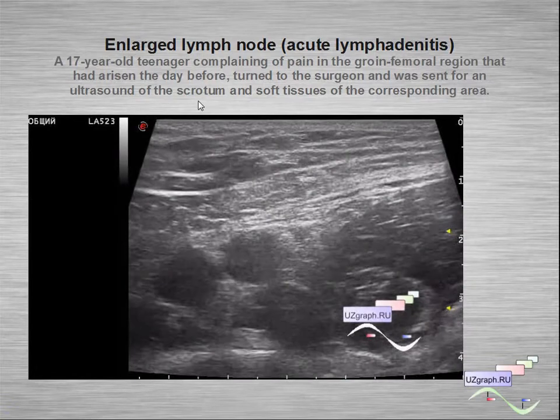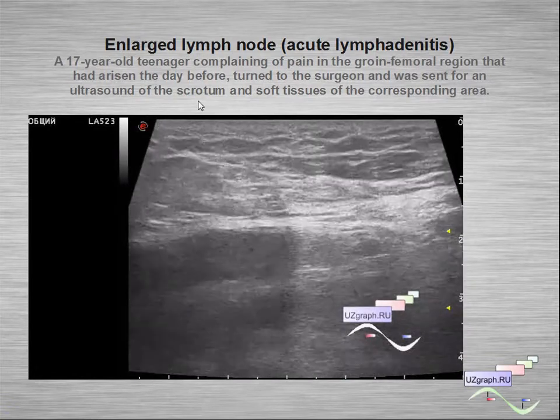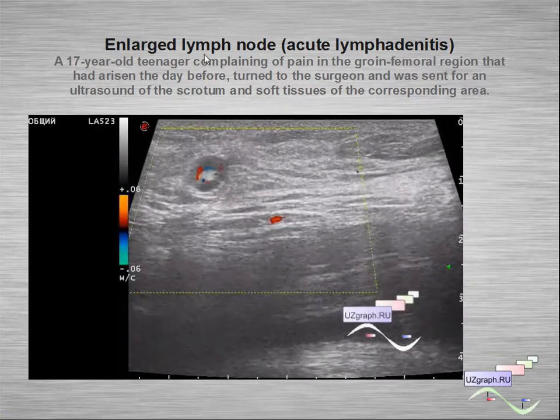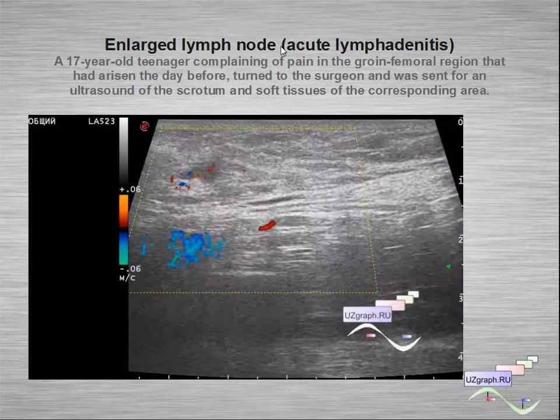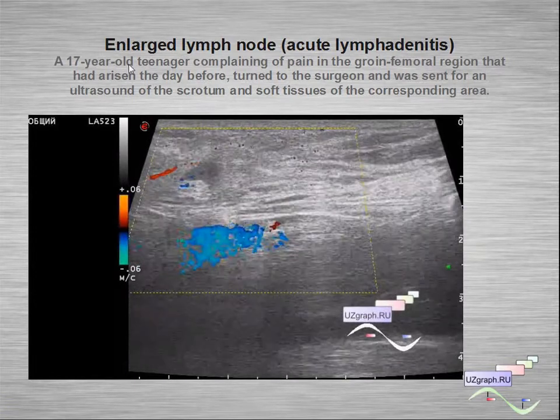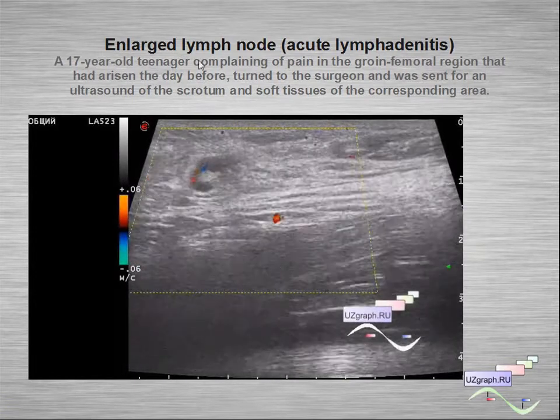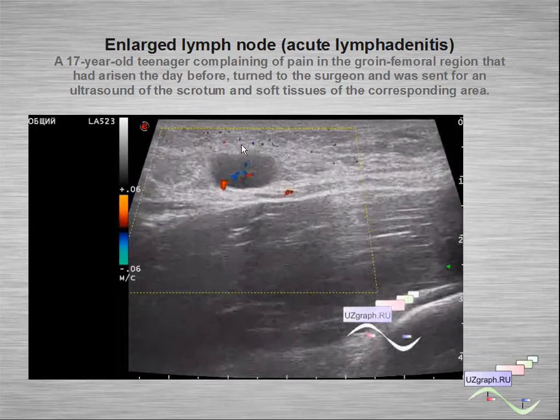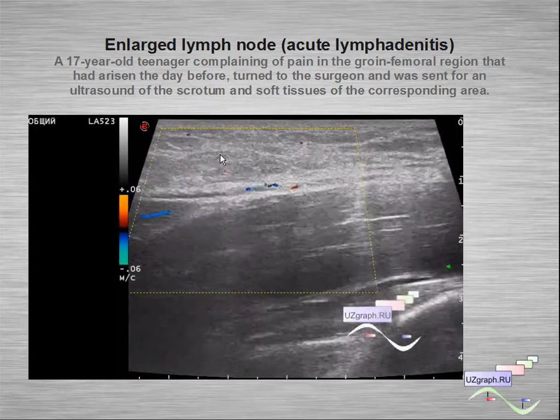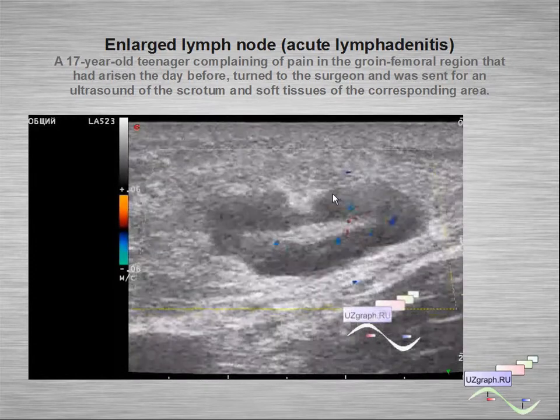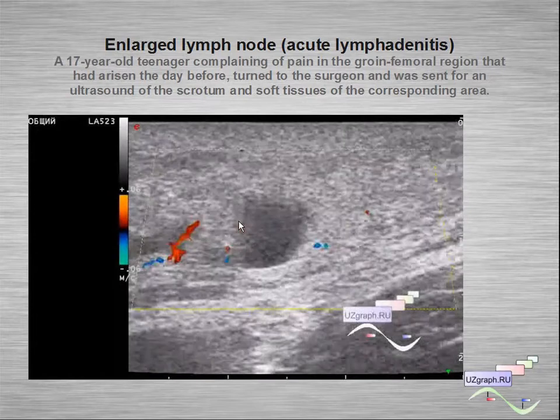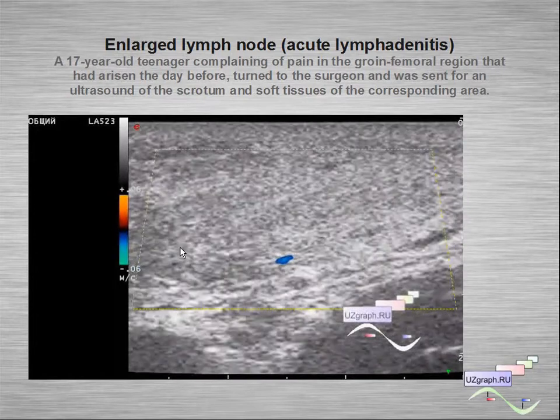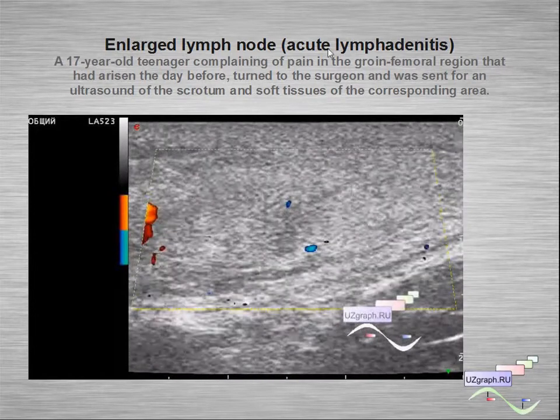In another case of a mass lesion in the groin: this is an enlarged lymph node in a teenager with complaints of pain. We can see a lymph node with increased blood flow. This is acute lymphadenitis.